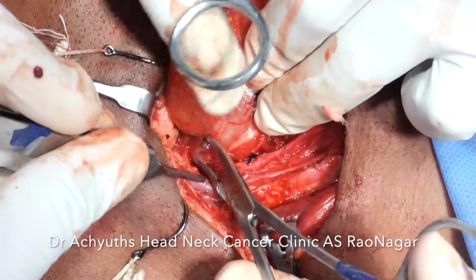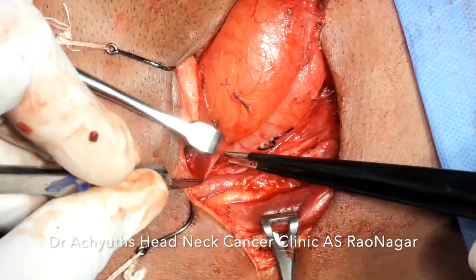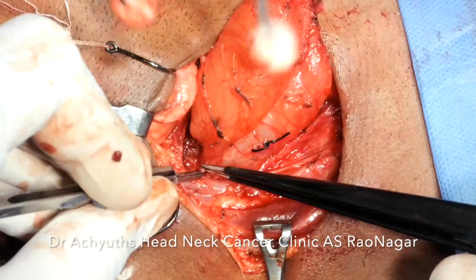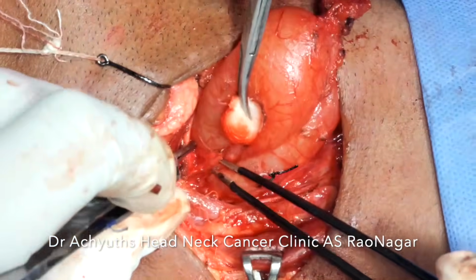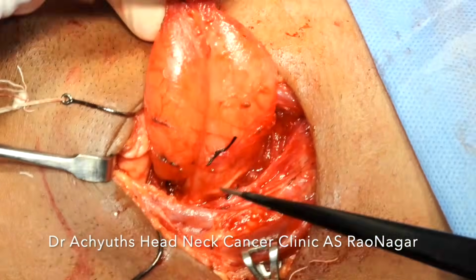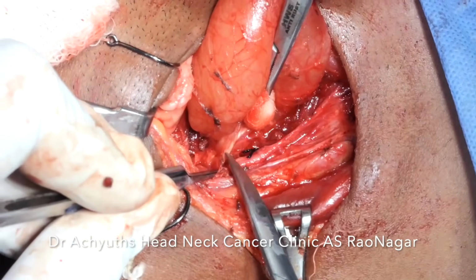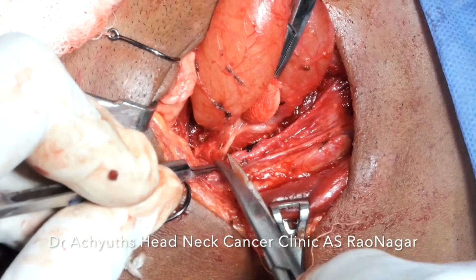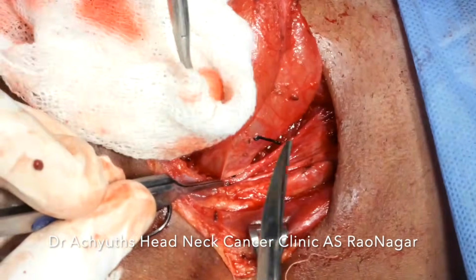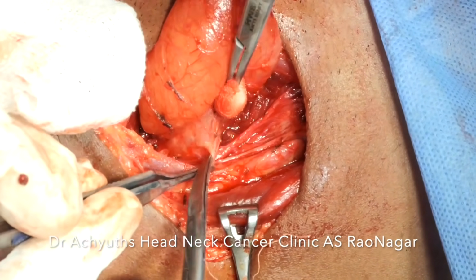One thing to note here is that it is always advisable to excise the cyst intact, but sometimes it is not possible, or without dissecting major anatomical structures, the delivery of the cyst intact is not possible. In those situations we try to decompress the cyst with a 5 ml or 10 ml syringe and then excise the cyst.